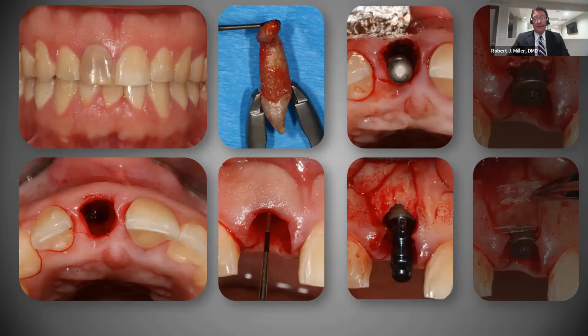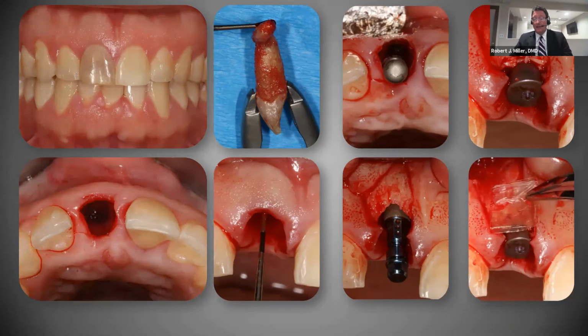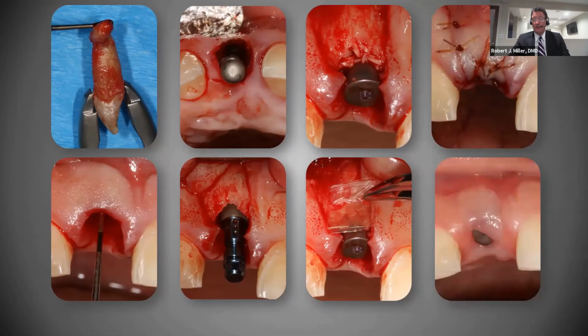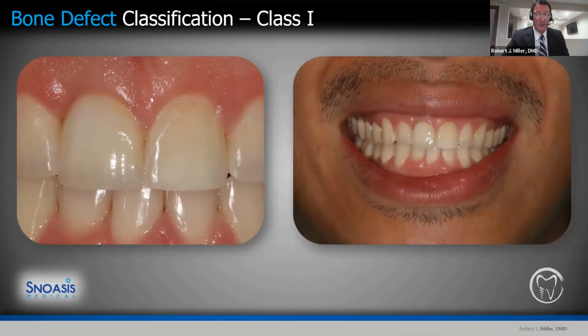I was able to reflect the small buccal flap, revealing that dehiscence type lesion, gap type lesion, grafted it with the freeze-dried bone allograft, placed a little BioXclude on top of the area, sutured, and allowed it to heal for about 3 to 4 months. You can see some really nice soft tissue response here, a little bit of a root eminence. And this here is your final restoration. Okay, we're able to match that fairly well.